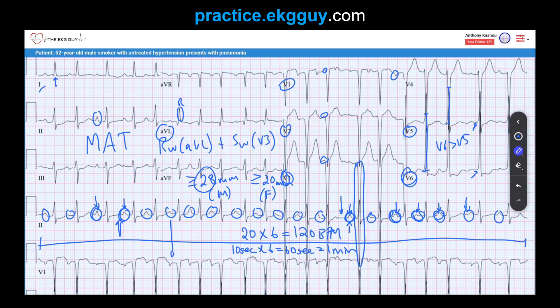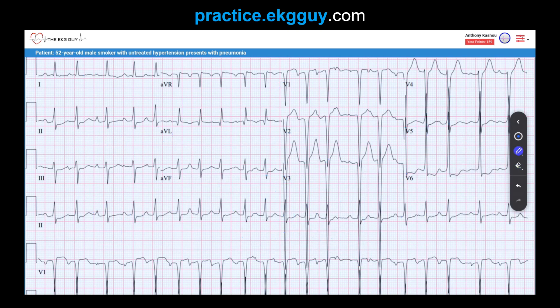Other criteria not met here involve limb leads: lead I requires at least 14 mm and aVL at least 12 mm. Another commonly used criteria uses precordial voltage: take the largest S-wave in the right precordial leads (V1 or V2) and add it to the largest R-wave in V5 or V6. For adults over 40, the sum must be greater than 35 millimeters.